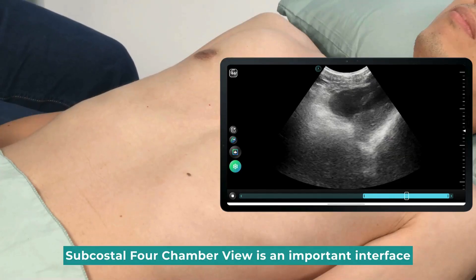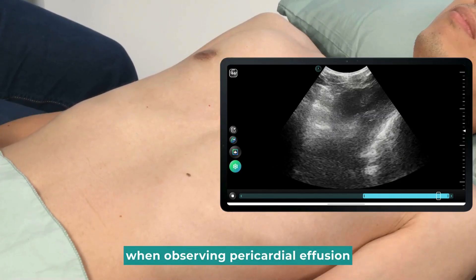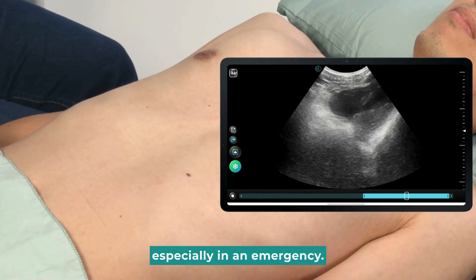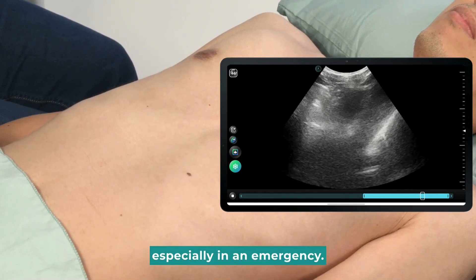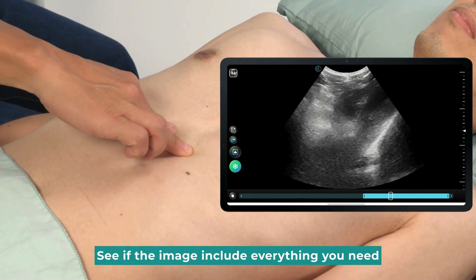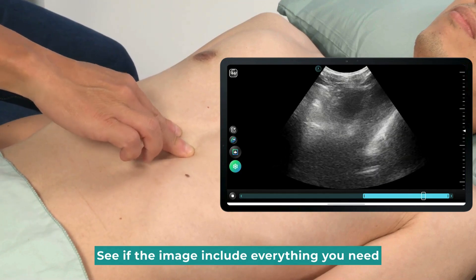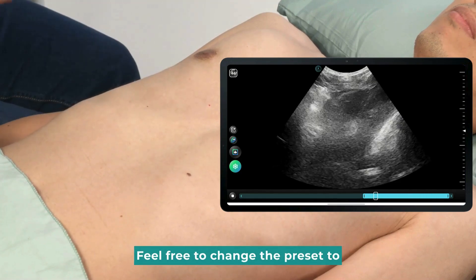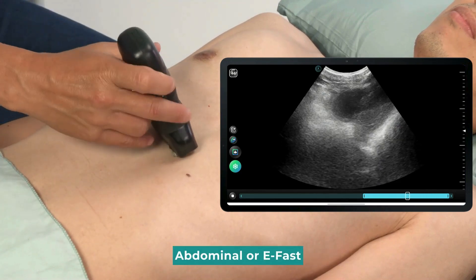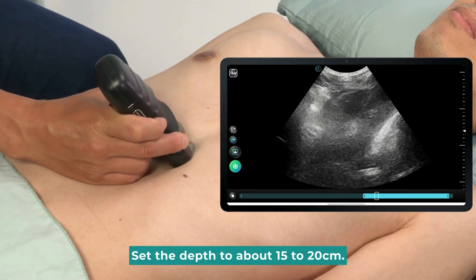Subcostal four-chamber view is an important interface when observing pericardial effusion, especially in an emergency. Let's place the probe horizontally. See if the image includes everything you need. Feel free to change the preset to Abdominal or E-Fast, and set the depth to about 15 to 20 cm.